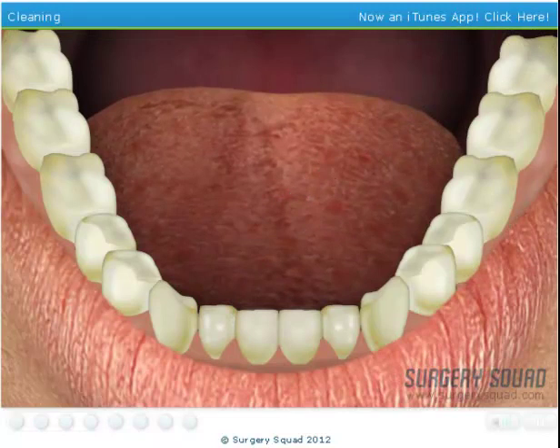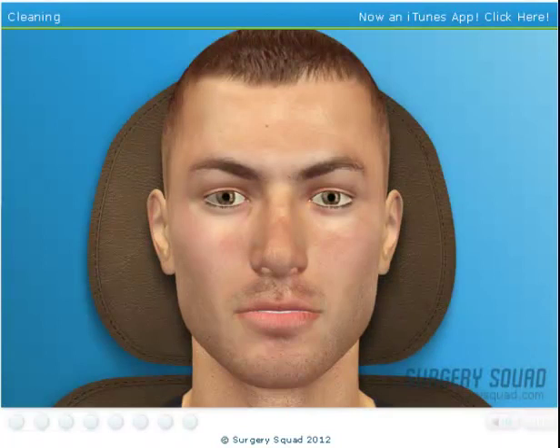Great job. I'll take it from here: 3, 1, 2. Based on the measurements, our patient could stand to floss a bit more regularly, but other than that, it appears that their gums are in good health.